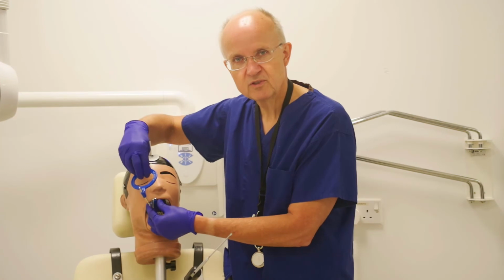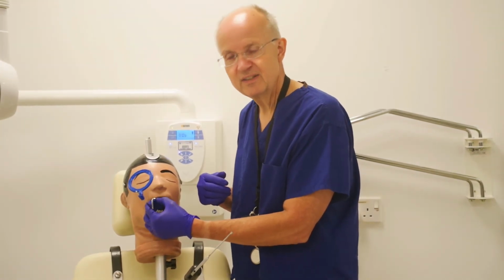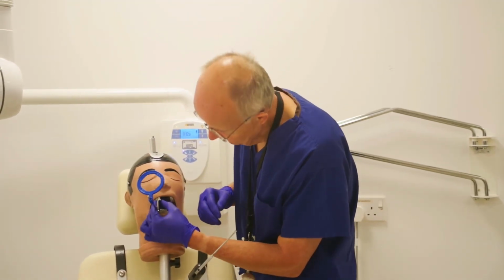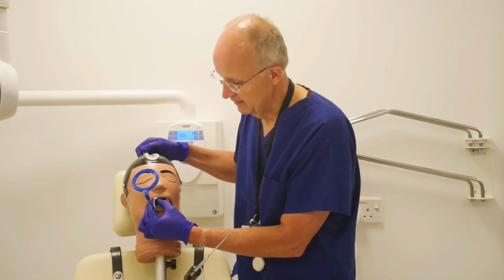And you can also, when you do that, feel whether it's touching the roof of the mouth, because if it is, it's going to bend. So you may have to just off-centre it slightly. Having got that into position, you then ask the patient to bite down onto it.